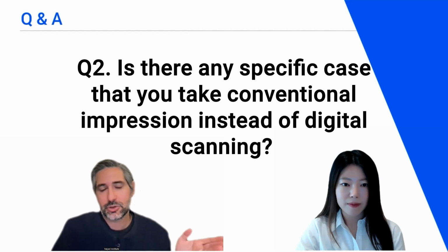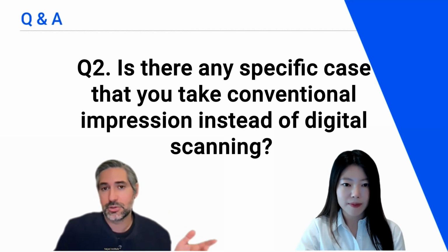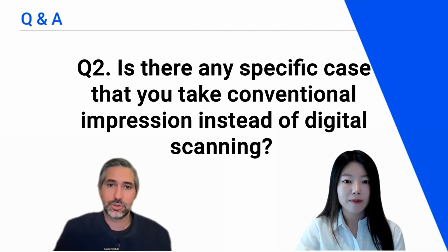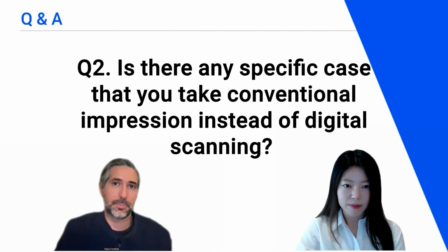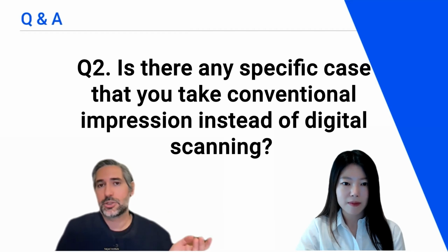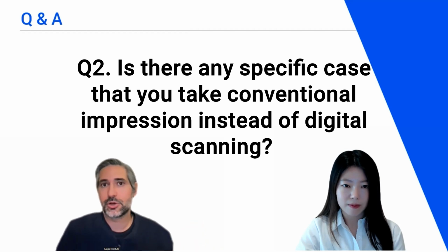And as I started to get more and more comfortable with it, and I saw that the scanning technology was changing, and basically once I started using the Medit i700, I started doing both a digital scan and an impression to compare the accuracy, just so I have a backup. I didn't want to be in trouble. And what I started finding is that the digital scan for single posteriors and for routine inlays, onlays, crowns was actually a little bit more precise.